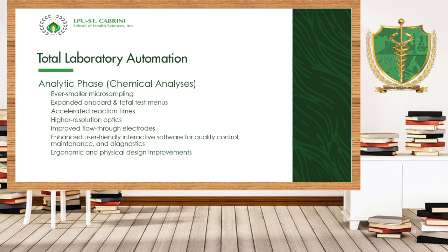Because aside from you knowing how to operate the machine itself, it must be friendly to you so that it will be easy for you to run the control and to do the maintenance. Now, I don't know why it's not included on the factors that you have to consider in automation. Yun yung isang factor na dapat natin tandaan, the maintenance of the machine.